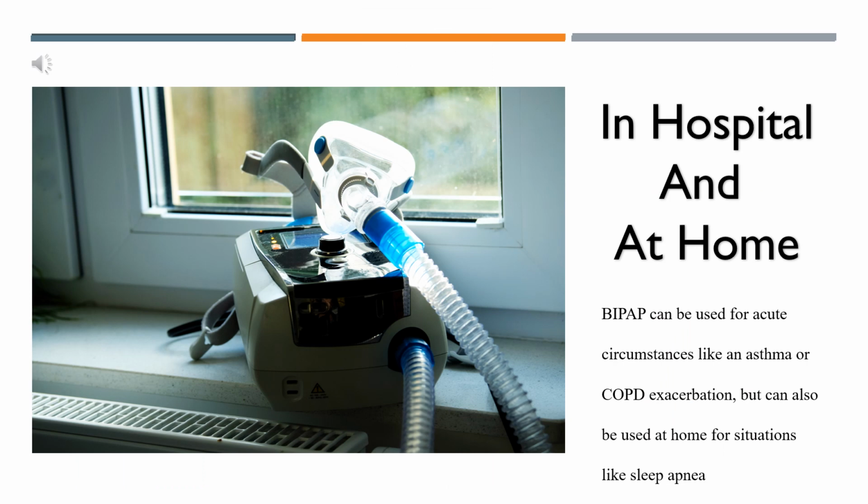BiPAP can be used for acute circumstances like asthma or COPD exacerbations, but also can be used at home for situations like sleep apnea.